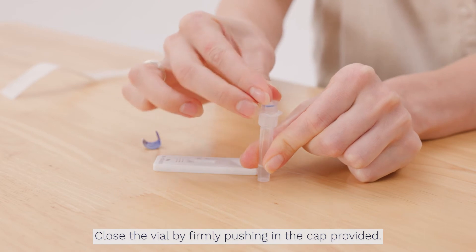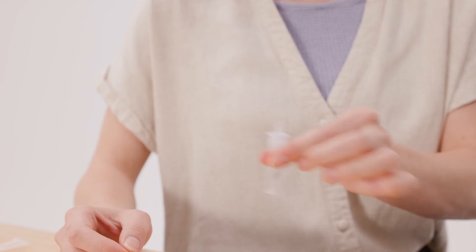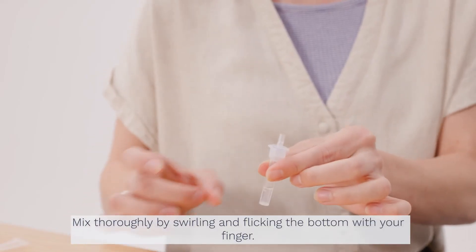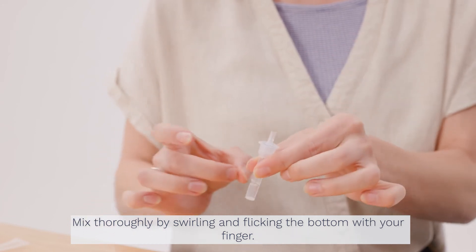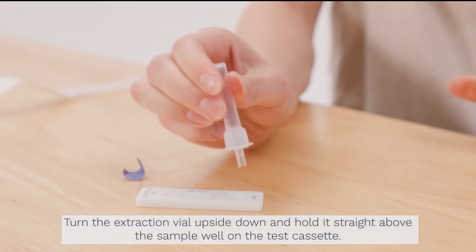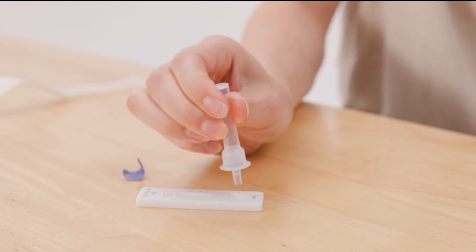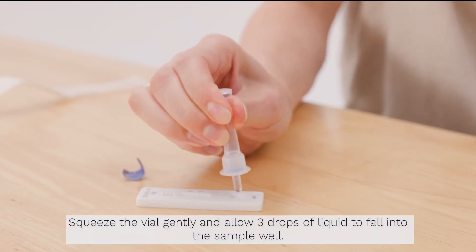Close the vial by firmly pushing in the cap provided. Mix thoroughly by swirling and flicking the bottom with your finger. Turn the extraction vial upside down and hold it straight above the sample well on the test cassette. Squeeze the vial gently and allow 3 drops of liquid to fall into the sample well.